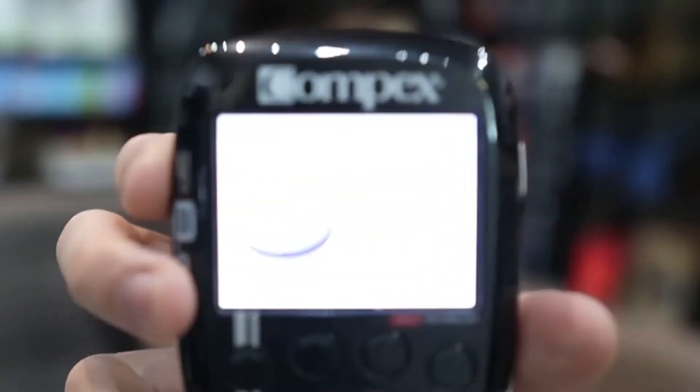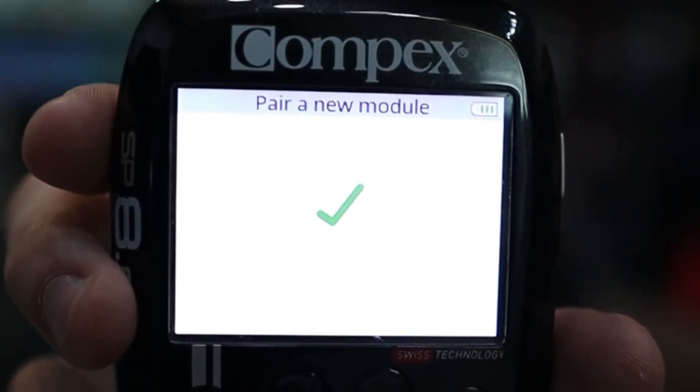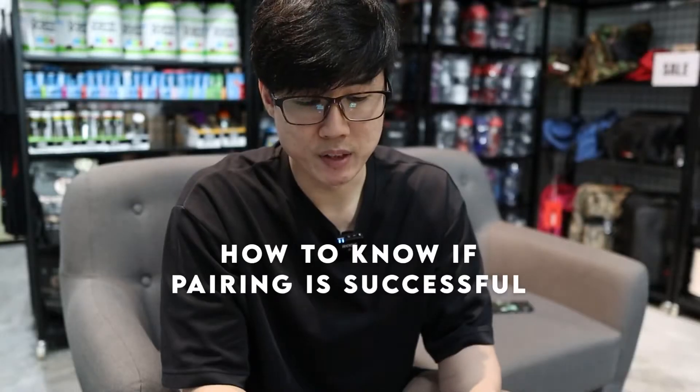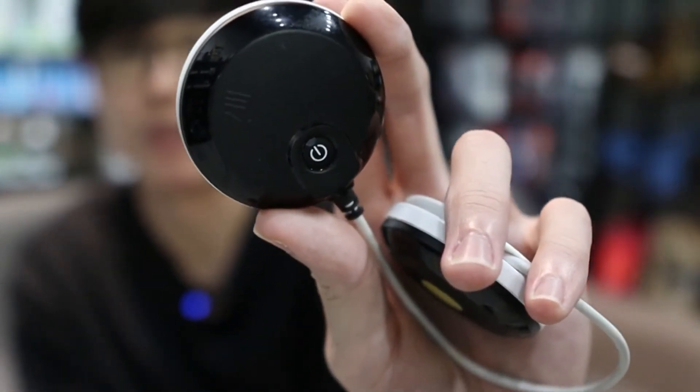Just turn it on and turn on your device, and it should show you a tick straight away. How do you know if it's paired? Just turn it off, and your module should turn off together as well without you doing anything.